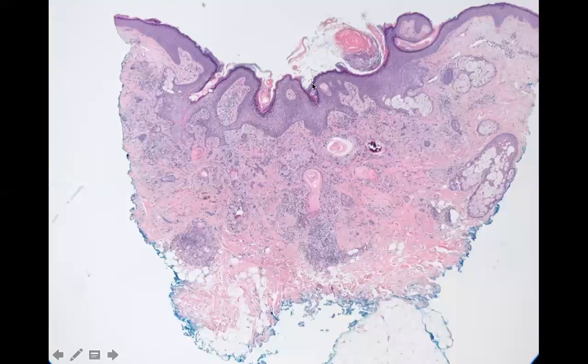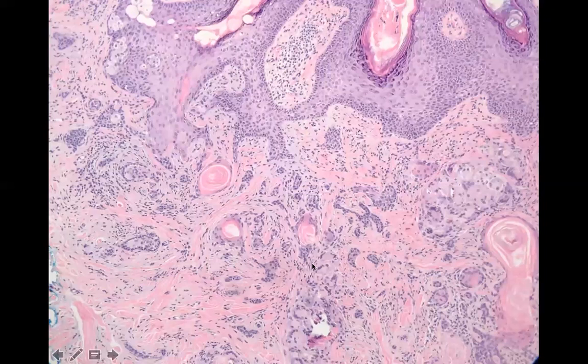So here, these are often like dimpled or umbilicated papules, right? So this is the epidermis getting pulled downward. Here are your little cystic structures. These are even ruptured with granulomatous inflammation around the little cystic structures, and then these little angulated nests. And then you can see that the tumor ends right here, right? It has this fibrotic stroma that kind of encases it. See that? And that's a desmoplastic trichoepithelioma.